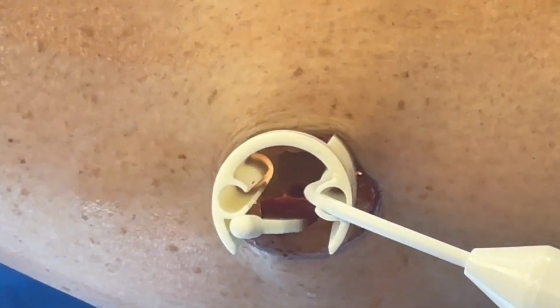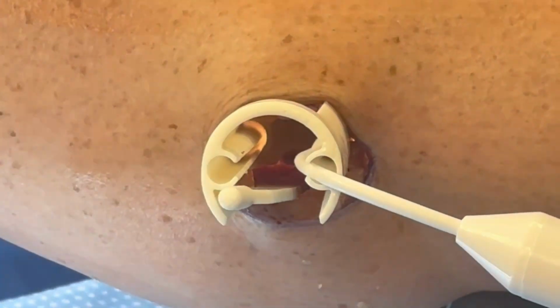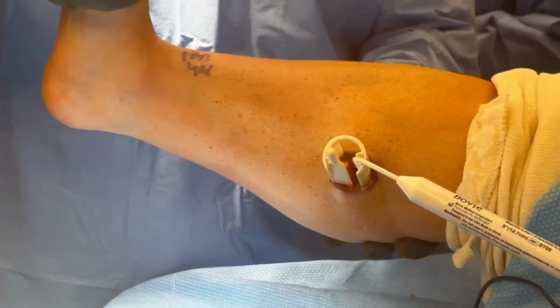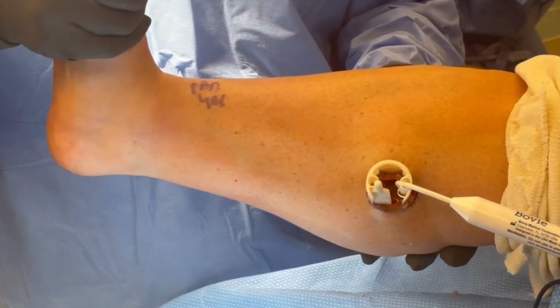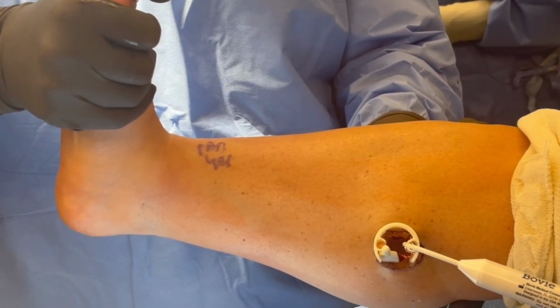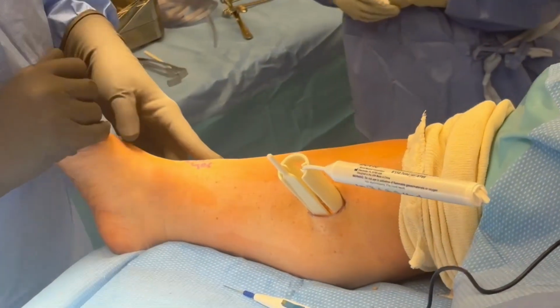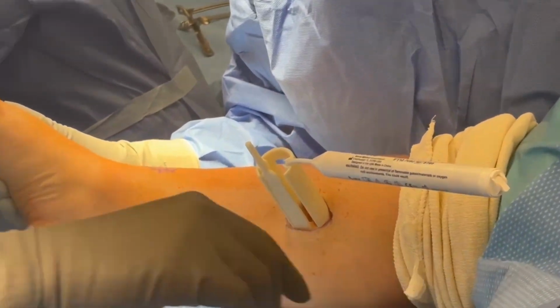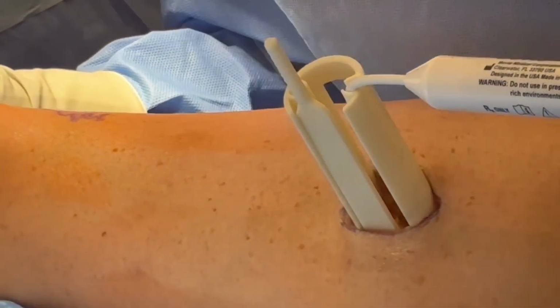Intraoperatively, I'm trying to get about 5 degrees, plus 5 degrees dorsiflexion. That's my goal. And you can see here we have a complete release. You can see the underlying muscle belly from the deep fascia. It's important to check intraoperatively.